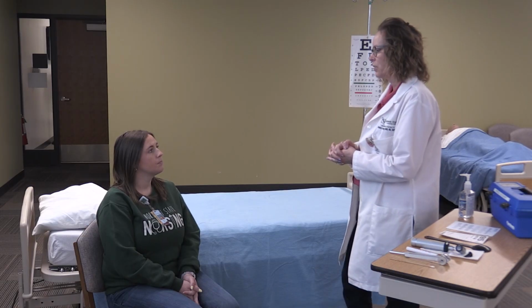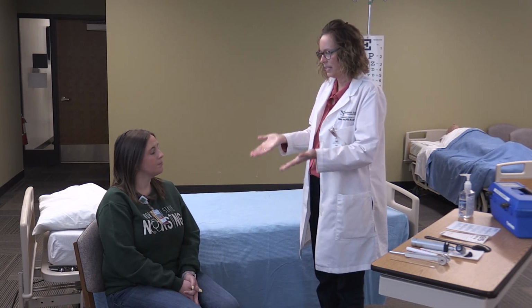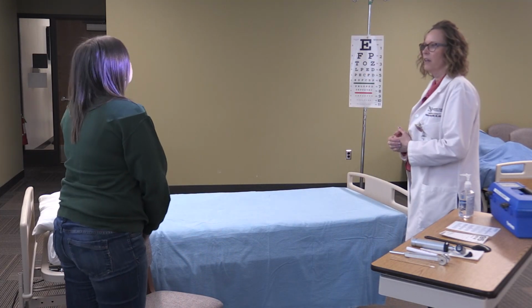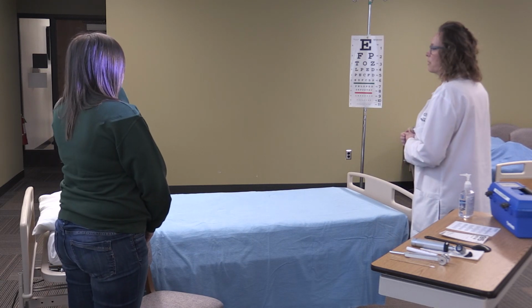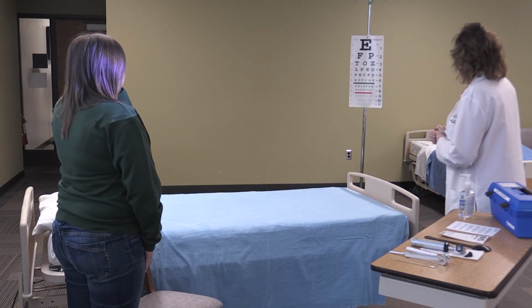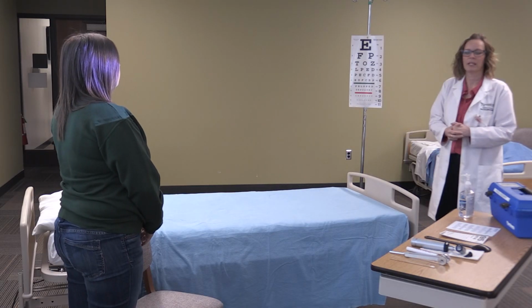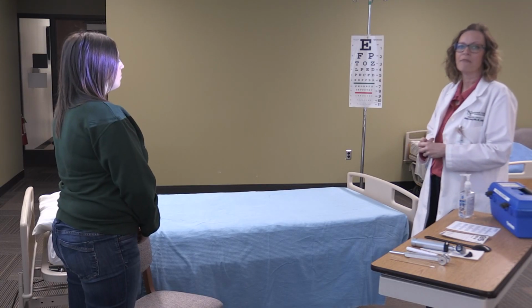So I'm going to test your far vision with a Snellen chart. So I'm going to have you stand up, and I'm going to have you face over here. The first thing I'm going to have you do is cover your left eye and read the lowest line that you can. LEFODPCT. All right, she read line 9, which is a 20/15, meaning she can read at 20 feet what people with normal vision can read at 15.